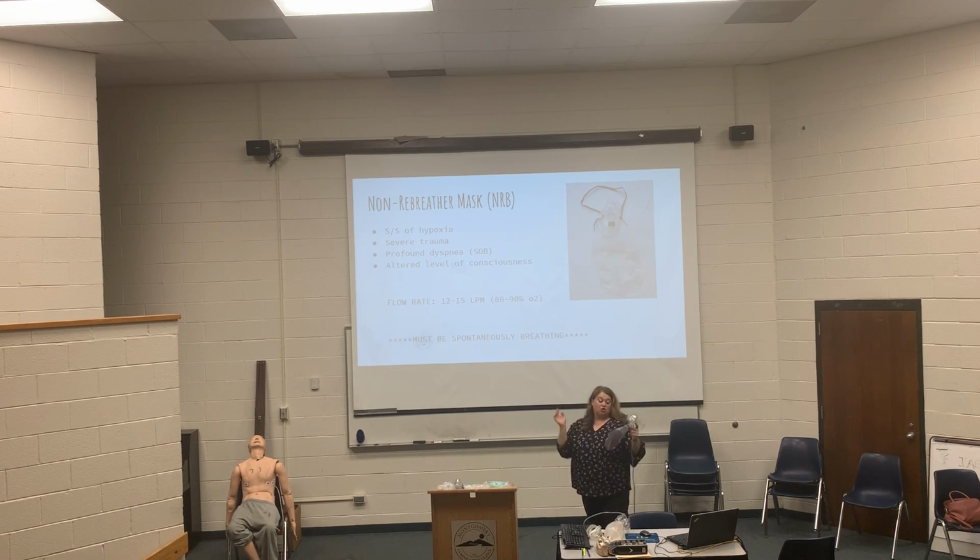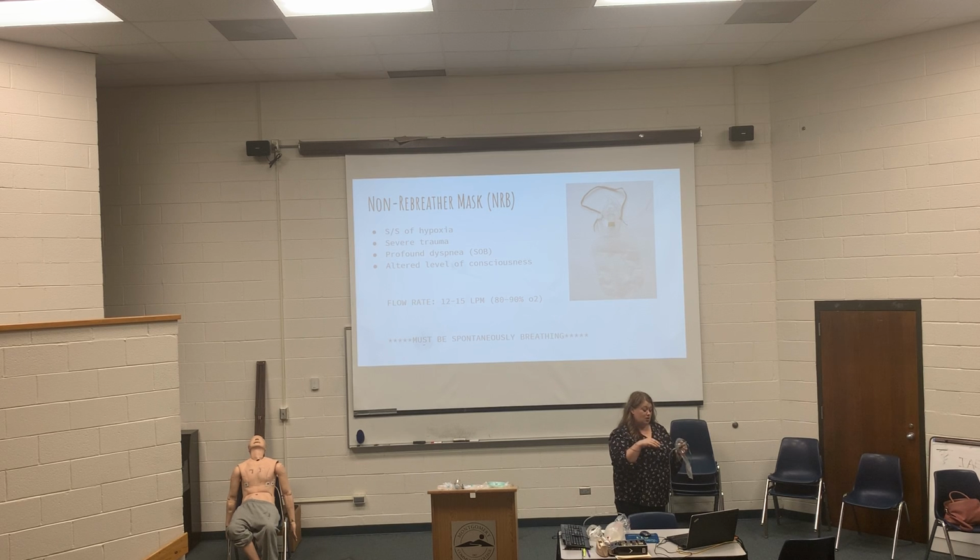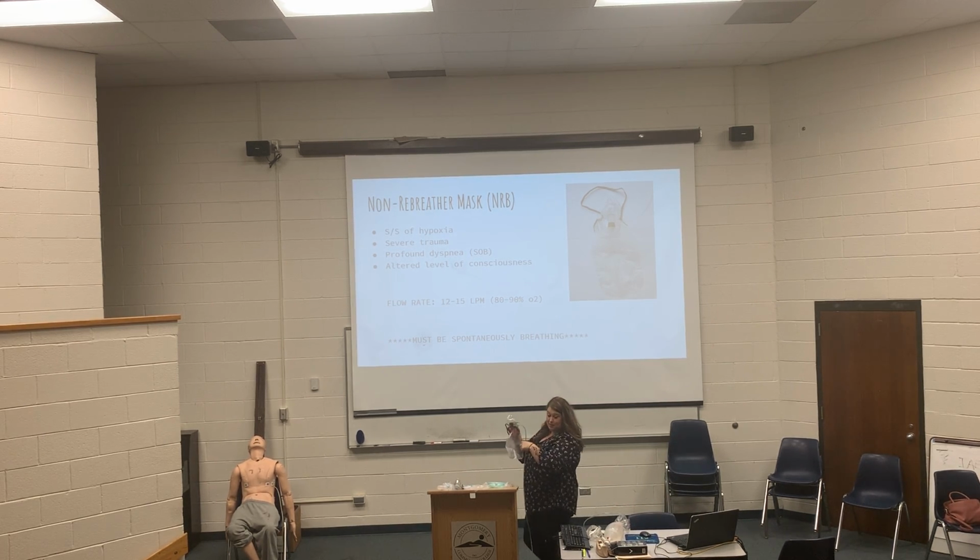So what happens with this is, the reason that they call this a non-rebreather is because they are not breathing back their own exhaled air. They're actually breathing the oxygen straight from the cylinder. And these things right here, when the patient is breathing out, it seals this. That's what this is for, so that it's not pushing the air that they breathe out back into the bag. It's just continuously getting new oxygen. And then when they take a deep breath in, this is like a little flutter valve, and so it lifts up, and that's what brings that oxygen in there.